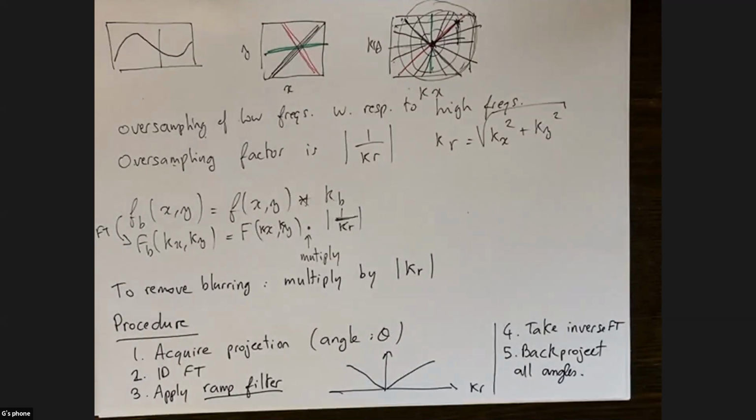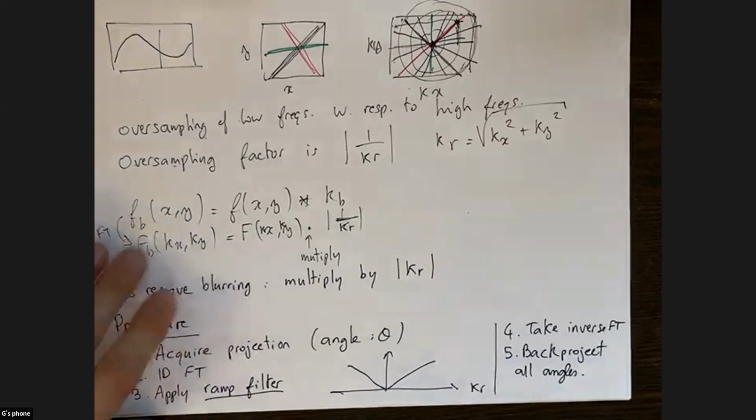Actually, I think I can finish the analytical reconstruction before the time. There's one last thing I wanted to discuss on this topic, and it's the impact on noise. Noise is an important problem in any type of engineering or imaging application, because noise is present everywhere, especially when few counts are being recorded by the scanners. There's going to be noise in the images.